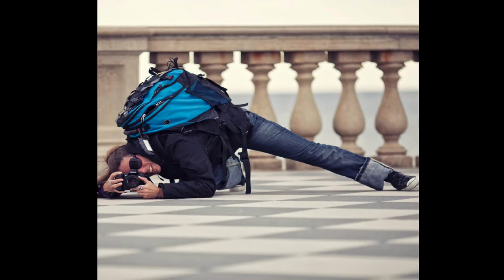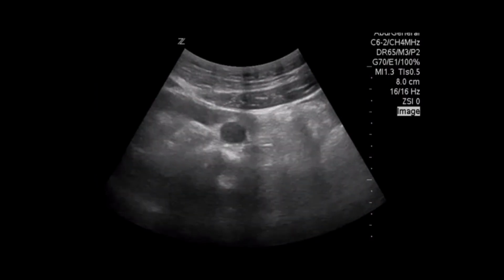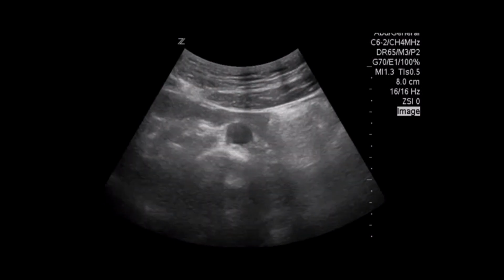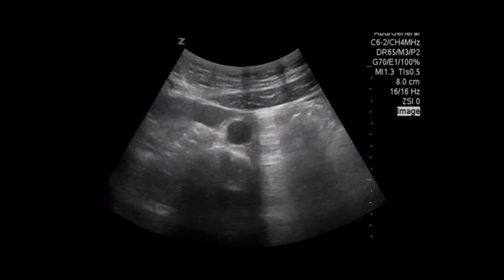A third strategy is to change the position of the patient. We've all been in the operating room and seen how the surgeons will use Trendelenburg and reverse Trendelenburg to change where the bowel is lying within the abdomen during surgery. Use this to your advantage. Be creative. Use Trendelenburg and reverse Trendelenburg and maybe use one of the lateral decubitus positions. Try all these techniques next time, and I think you'll have great success.